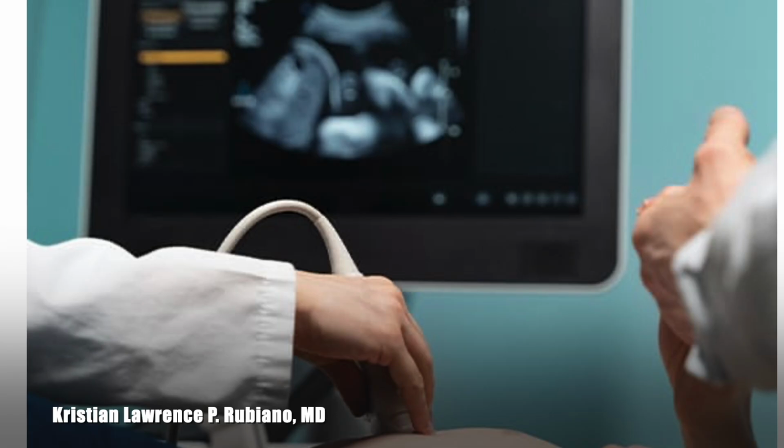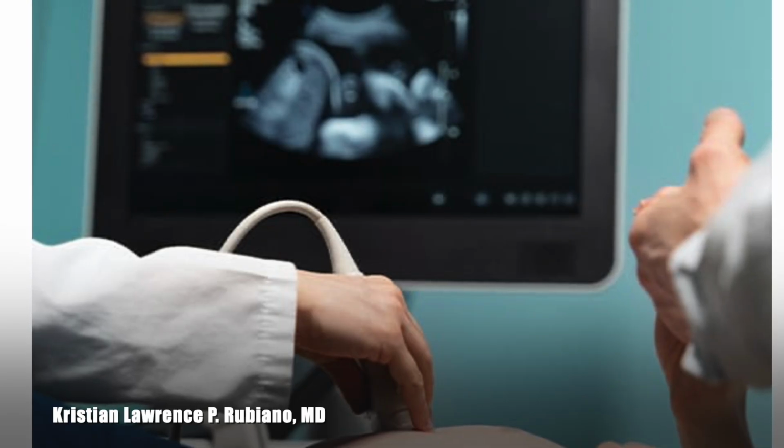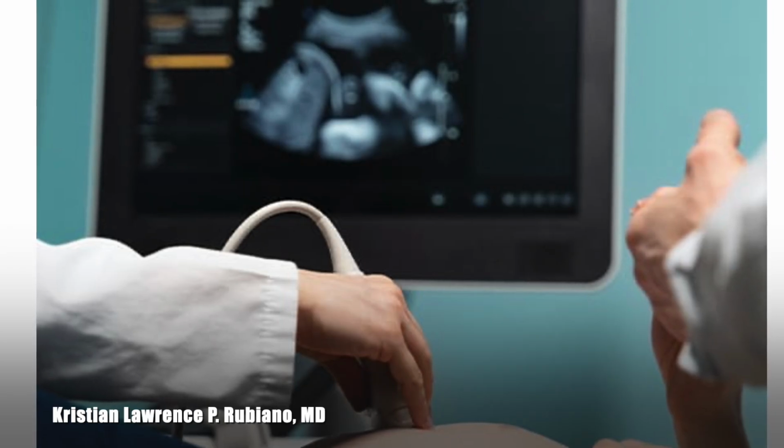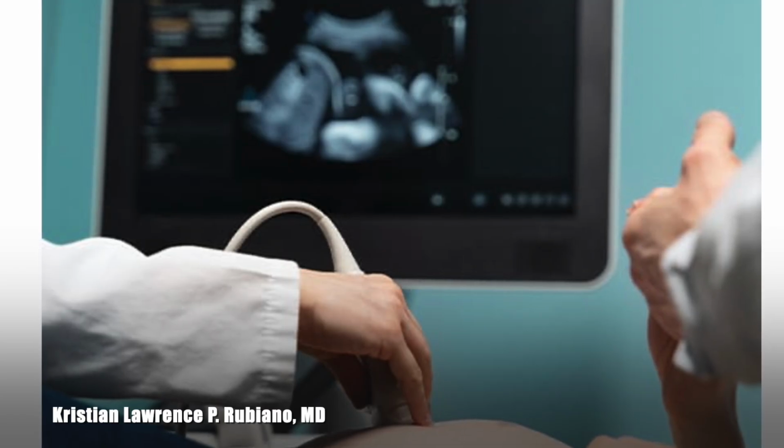To do this view, bigger kids would need to flex their knees to relax the abdominal muscles, and use some breathing techniques for better visualization of the subcostal area. The probe is placed on the subxiphoid area, angulated upward, tail down to view the cardiac structures.